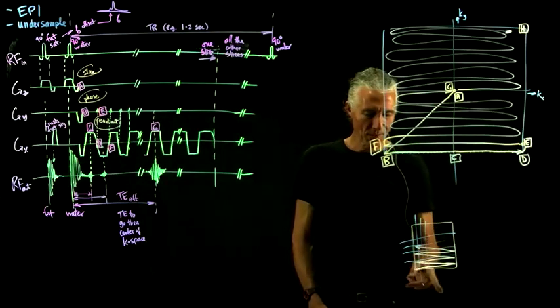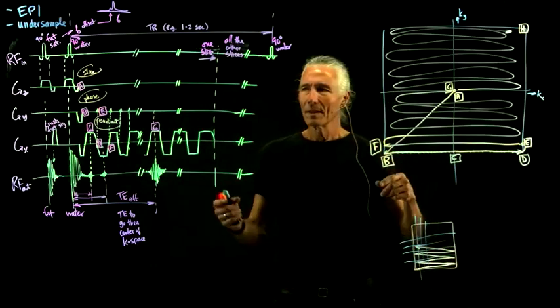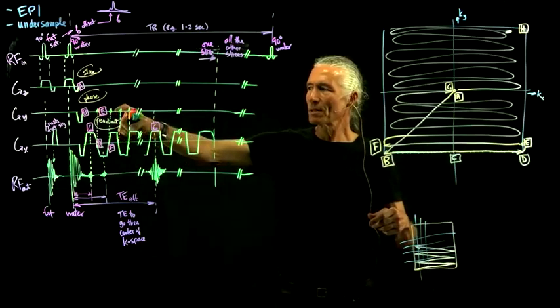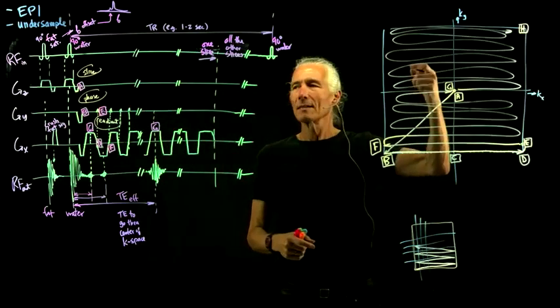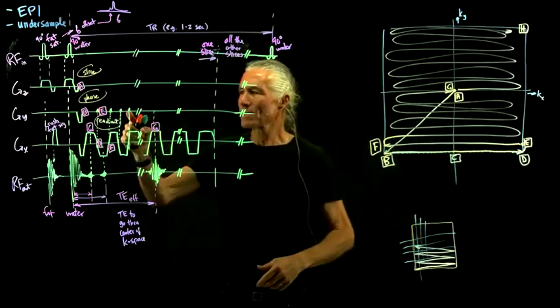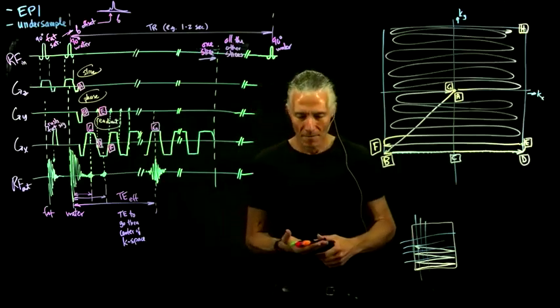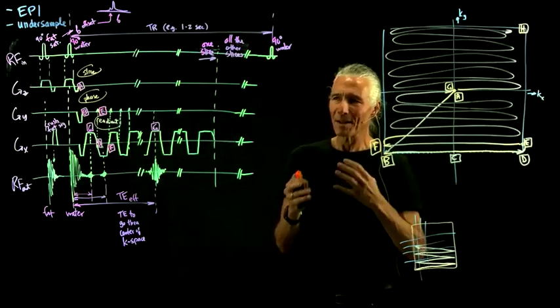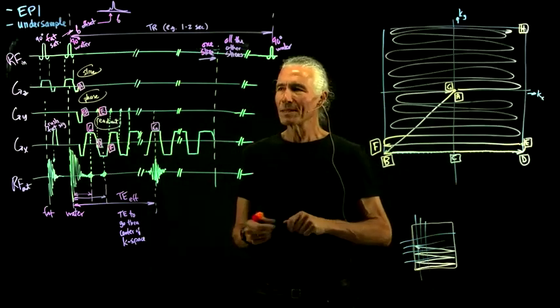So that's the very original echo-planar imaging: just turn the phase encode gradient on at a small level and keep it on the whole time, and that will slowly advance you in the direction across k-space. Now they just do these little tiny blips. And what is the main reason that made this possible? It's mainly improvements in amplifiers.